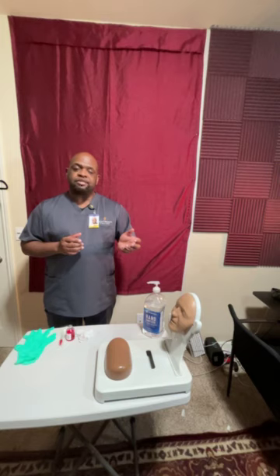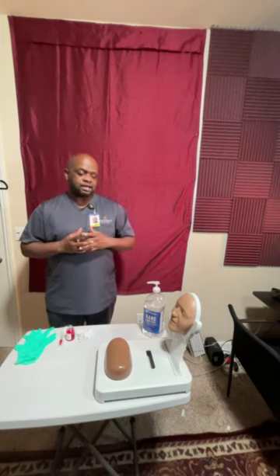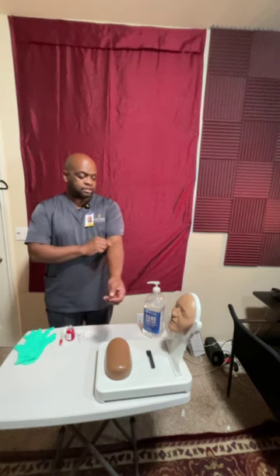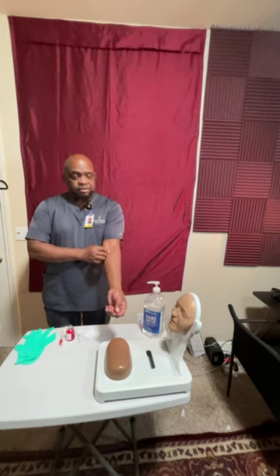And I will also explain to Mr. Jones the actions of this medication. The way that this works is that we will inject a small amount of the medication right up under the epidermis layer of the skin, forming a little blister right there under the skin.